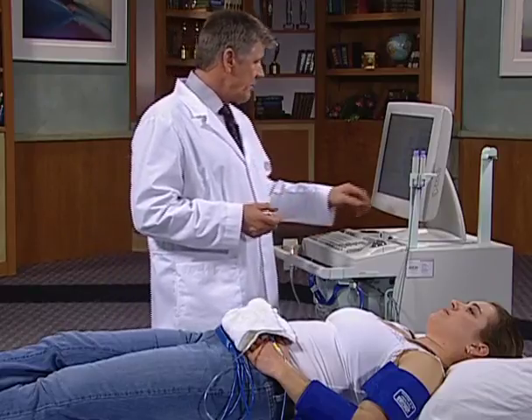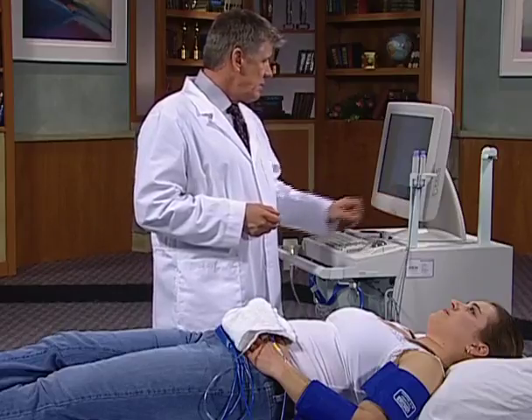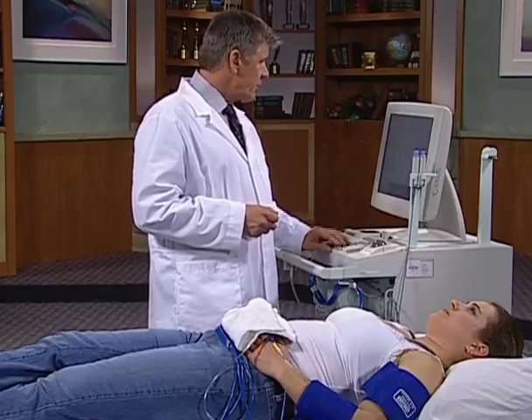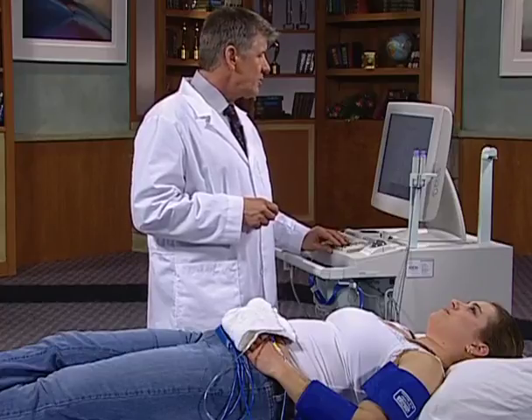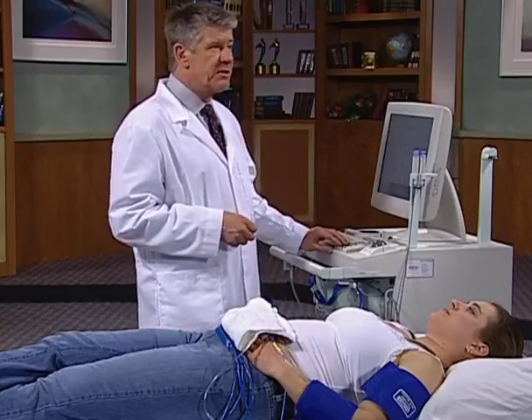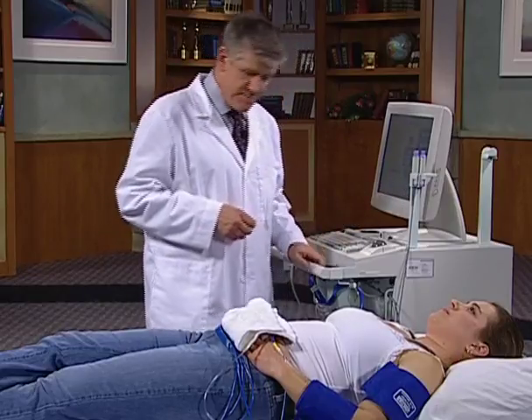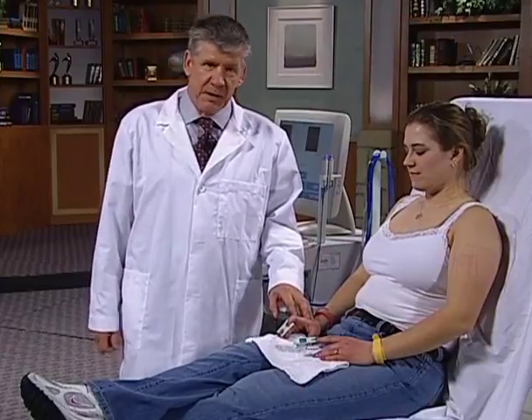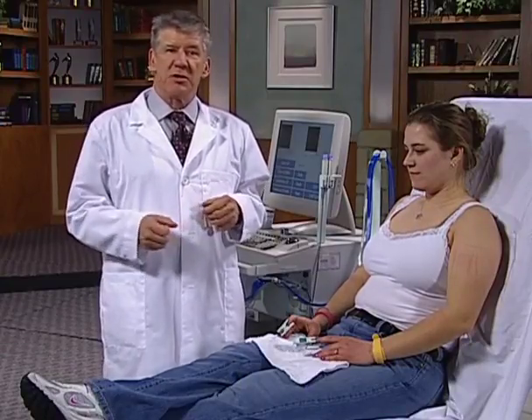So we've now accomplished a PVR study. We've acquired digital PVR signals, which both look normal, and our pressures throughout the arm on the right side look normal as well. We're skipping the left pressures for the sake of this demonstration, but we've accomplished a good baseline study here. Going to demonstrate how to do a thoracic outlet test. And this is for those patients that will present with intermittent pain or tingling or swelling, whatever, with their arm in specific positions.